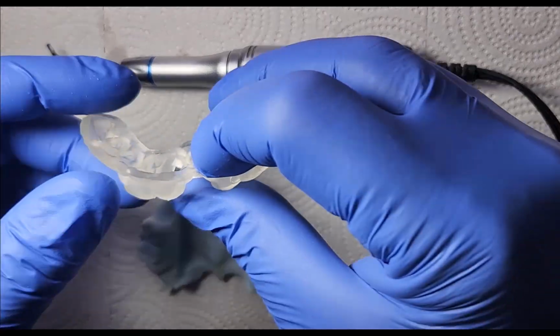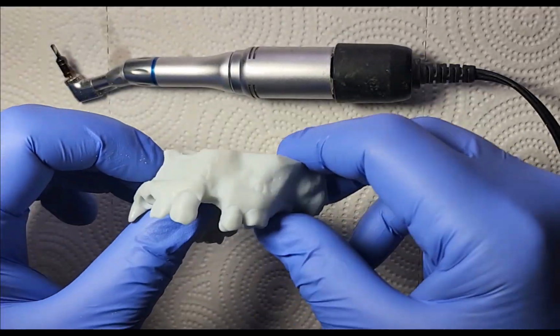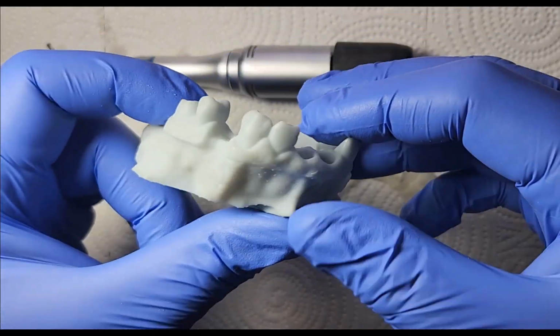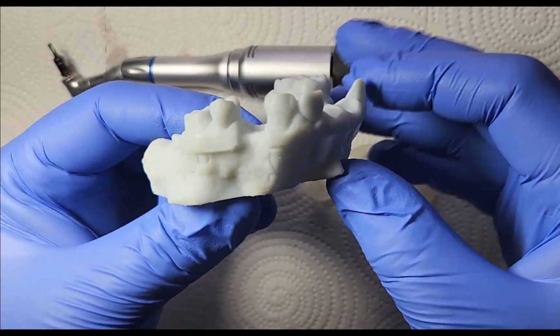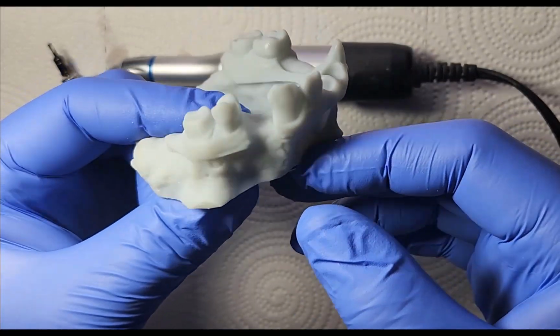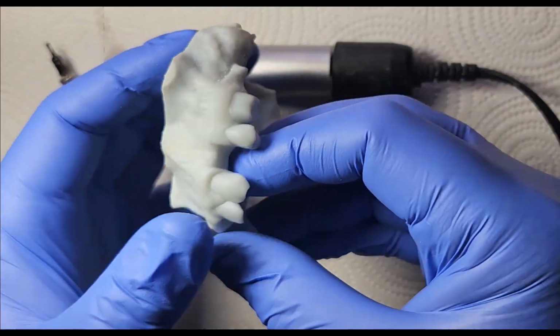Okay, so we've got our guide printed, and we're going to go ahead and just do a mock surgery on this case. And so here's the model. Now it's not going to be exactly like real life because obviously I've just arbitrarily kind of removed the gingiva here, and so this just represents bone. So in a real case you would lay a flap, obviously.